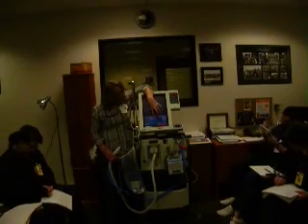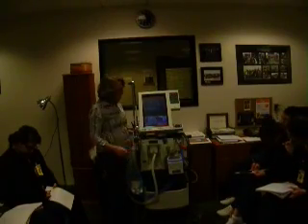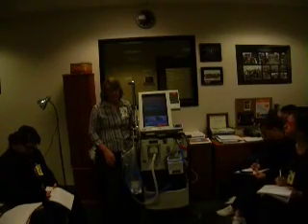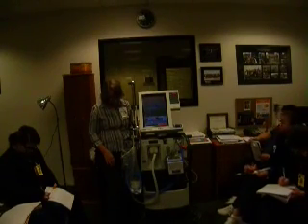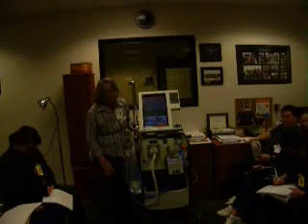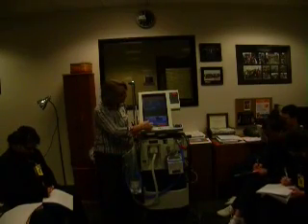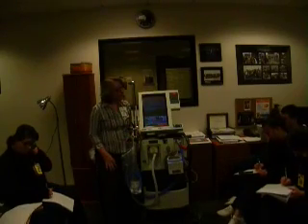Then you're going to see square or ramp or something along those lines. You'll see a little pattern. Ramp is where you want that to be. That's our flow pattern, which I'll talk about more later. It will all make sense. You just need to see where everything is right now. And then underneath this little bar, you can see your I time and your E time and your I to E ratio.